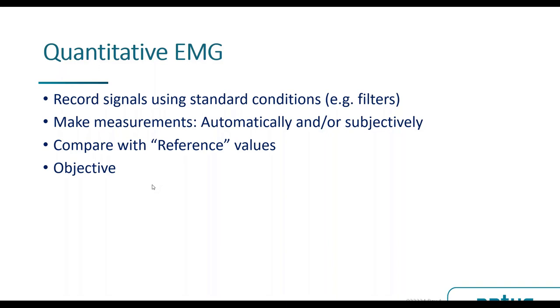When we are familiar with quantitative analysis, we can also listen to the signals easily, we can capture them easily, and when things appear complicated, difficult, mixed, and you are not sure which way the abnormality is, knowledge of quantitative analysis can actually guide you in the right direction. So to me, that's the important thing for quantitative EMG.